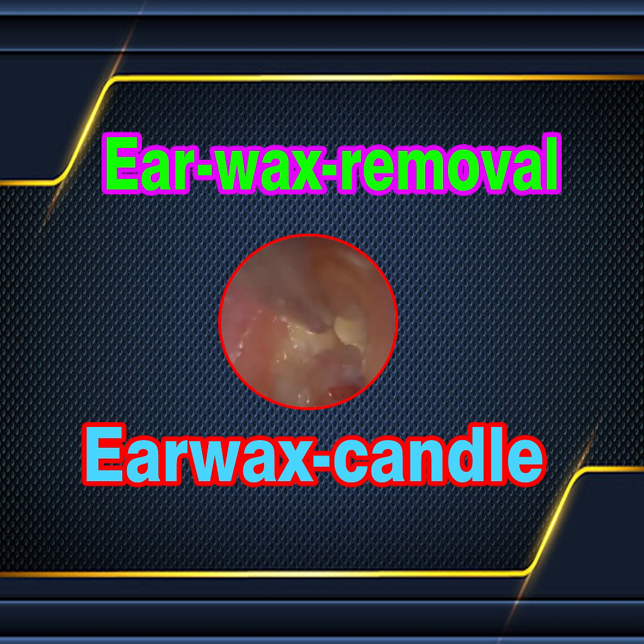Slowly peeling that away. The tail end of that is just blocking the suction probe there. Just gave it a little wriggle. The tail end of that is attached to the eardrum. Be really gentle in bringing the suction probe away. I want to go sideways. I don't want to go towards the eardrum any further.